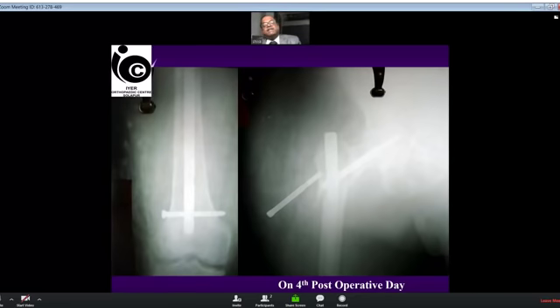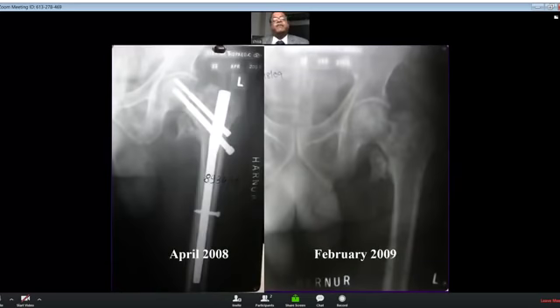The initial 5 or 6 cases, all these 5 or 6 cases, I took back again to the OT, tried to reinsert the screw, different screws in different directions, but all of them came out on the second or third day again. So I came to the conclusion that there is something inherent problem which is working. So already probably the first screw has caused a lot of damage to the fixation also.